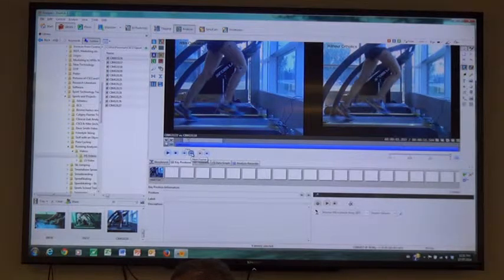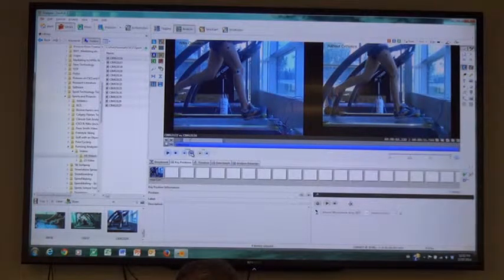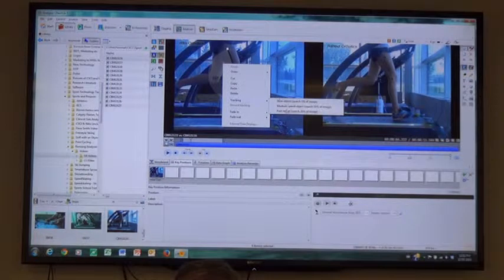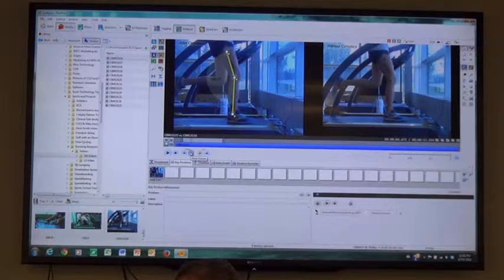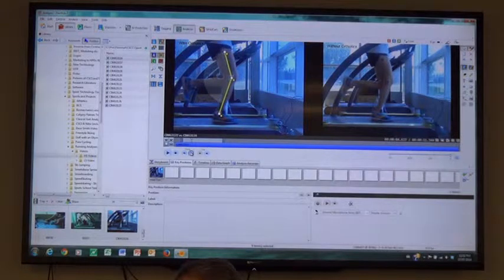We're able to look at specific aspects of her knee angle as we track it. I'm going to put that tracking back on. Sorry, I lost it. So you can track any object, and by putting these black marks on her leg, it's able to track the knee angle throughout the movement very nicely. Okay, so I'm just going frame by frame ahead, and it's tracking that knee angle.